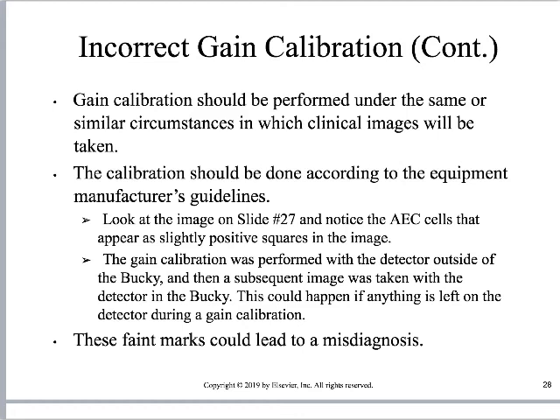So sometimes this requires an engineer to come in. Sometimes it's just part of the actual setup and daily calibration checks. So again, if you're asking, how would I fix this, right? The question might be, is the early morning tech doing the manufacturer's required engineering setup? Are they doing the gain calibration setup correctly? And that actually is a big question, because oftentimes human error is what can introduce these faint problems.